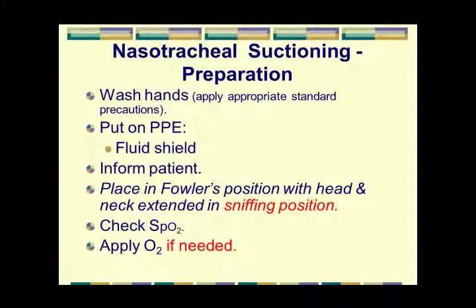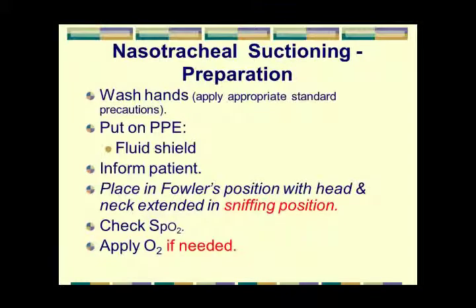But what we're going to do is wash our hands, put on our personal protection, and put them in a position where they can easily access the trachea, what is called the sniffing position. You guys know what that is, right? How do you sniff something? You lean your head forward and extend your neck. Literally, that's what you end up doing with the patient.